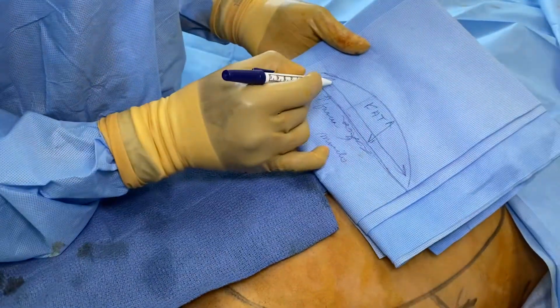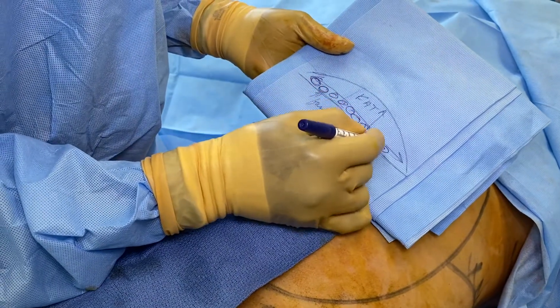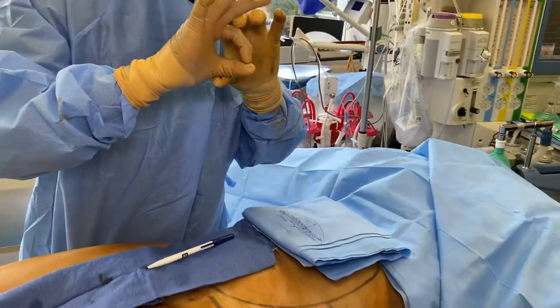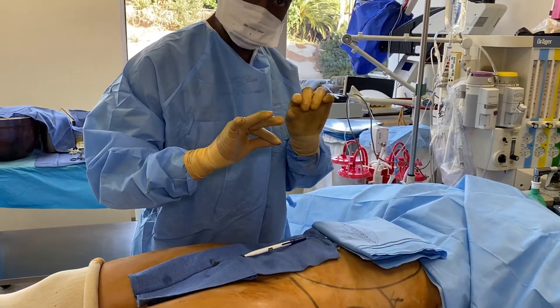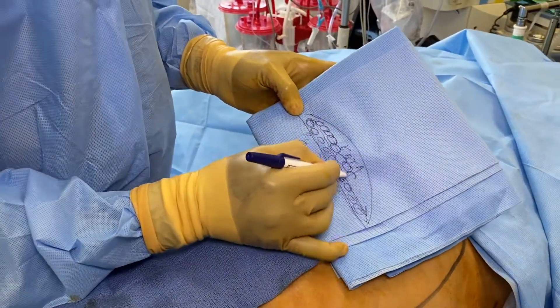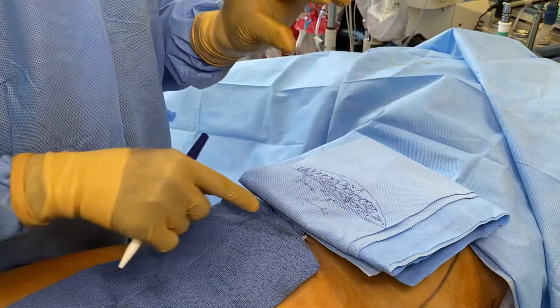Basically I'm making tunnels throughout. We go in the deep layer, making tunnels. It's a tunnel — so what happens? It collapses. That's how we're decreasing this. Then I'm going to go up higher in the mid part, making more tunnels. We've got to be good, exact, and strategic so it's smooth and regular. So now it's further collapsing.